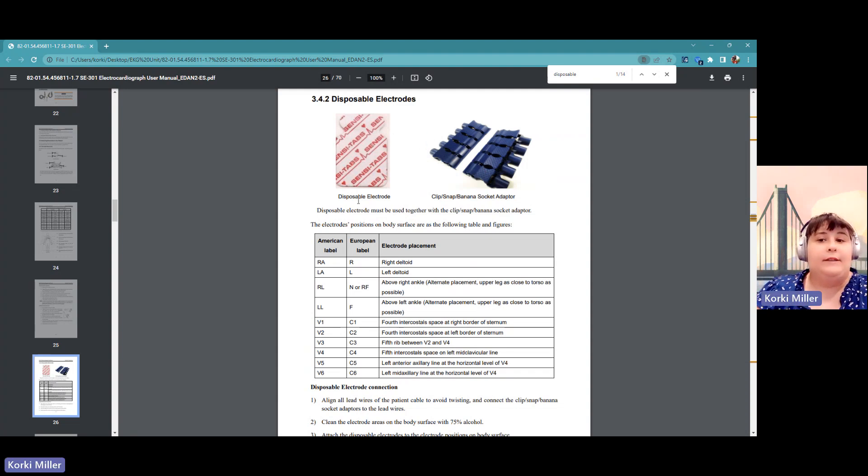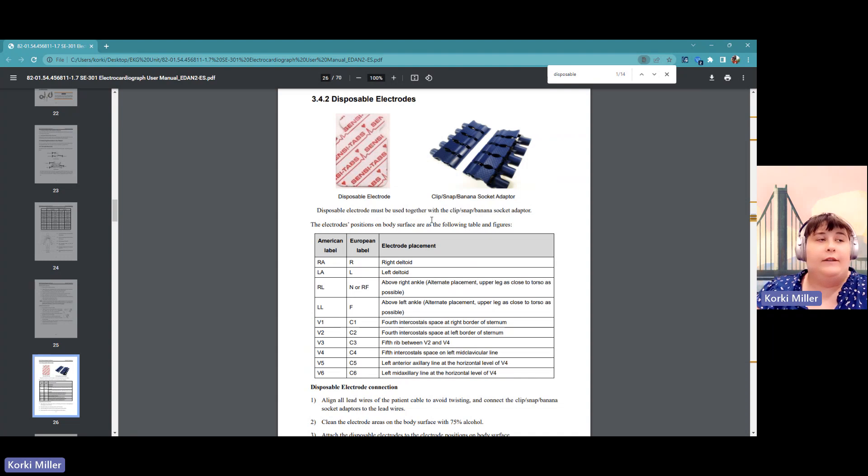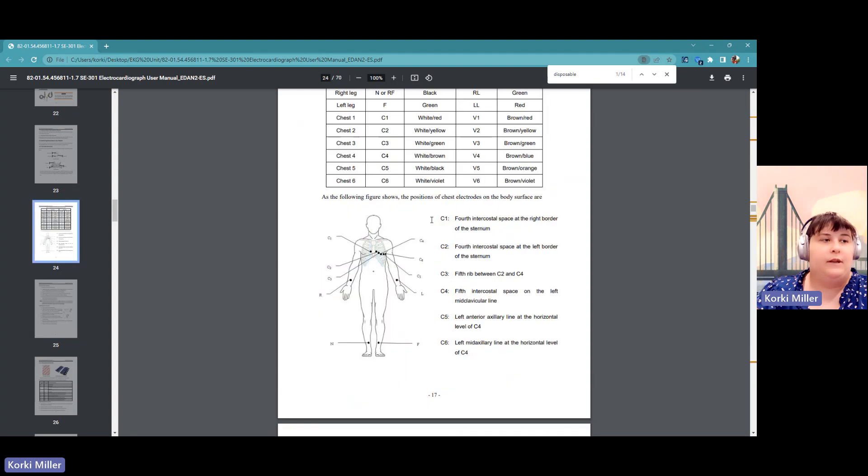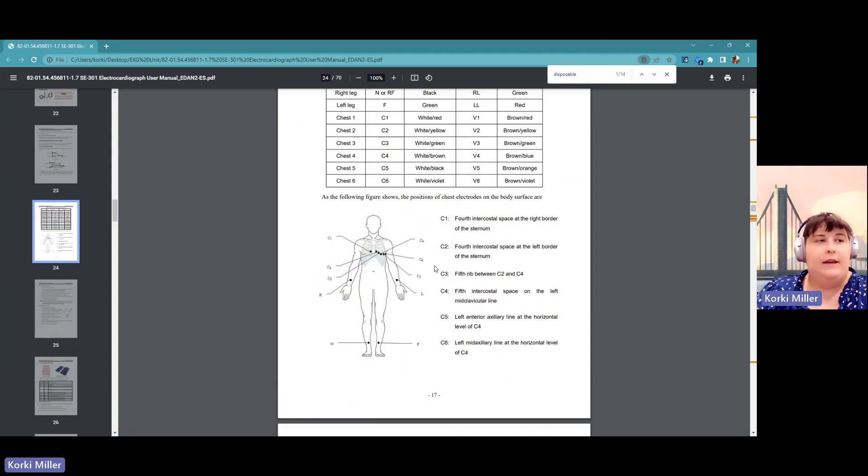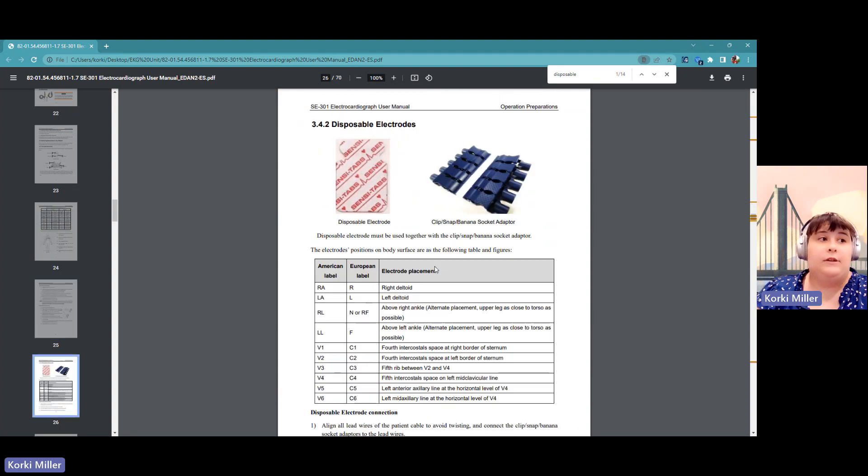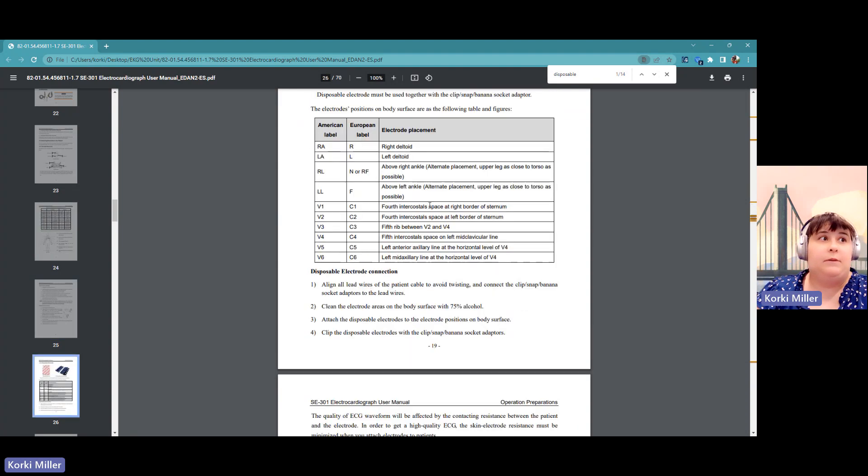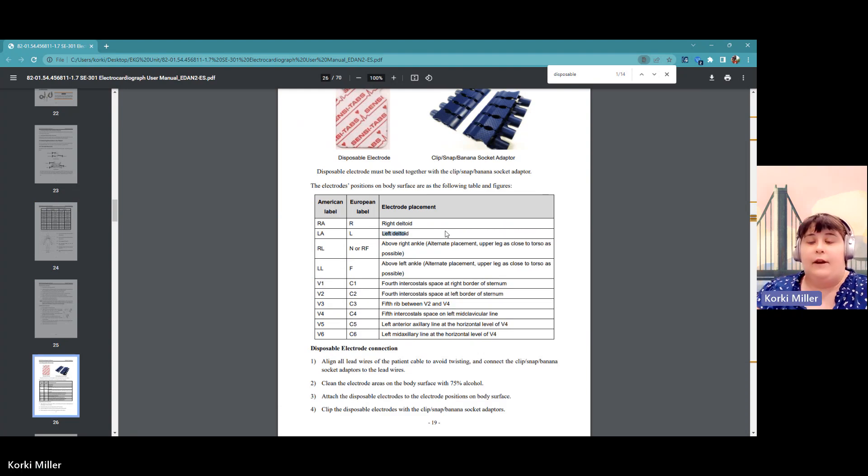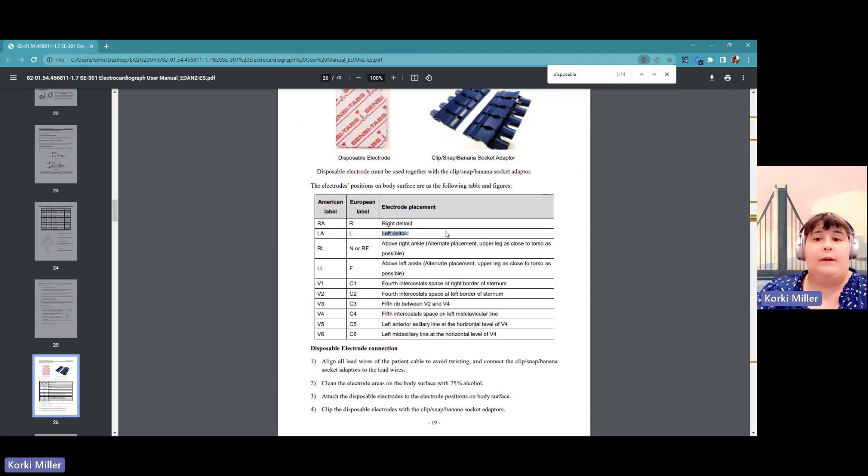While it is known as normal practice to put the limb leads down on the forearms, on the legs, that is for reusable electrodes or disposable electrodes, it is recommended to put them on the deltoid area. So if you're having difficulty acquiring signal, that might be somewhere to look at.